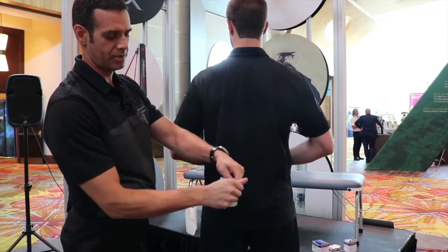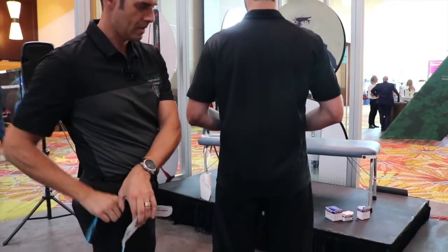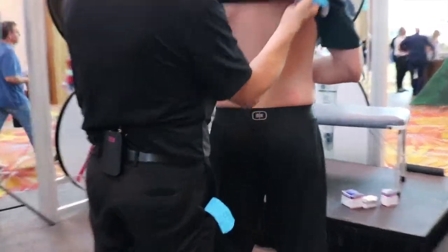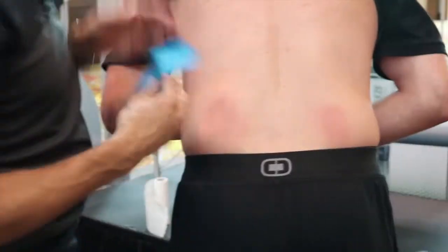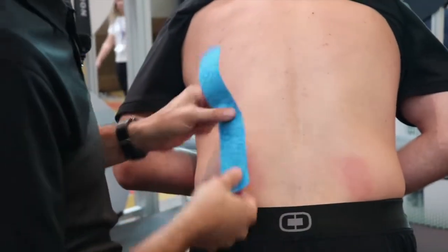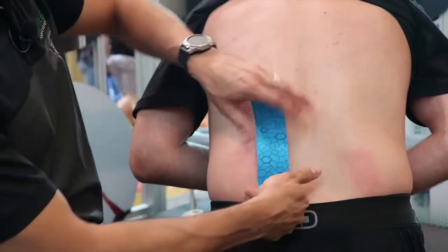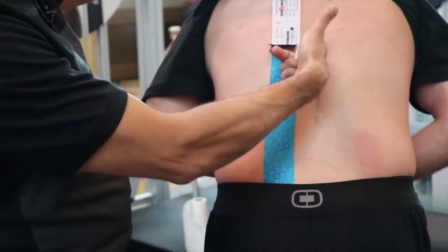So we're going to break a base where we're going to start by affixing the tape to his low back. So we'll lift up his shirt. And what I'm going to have him do is I just want him to put a little tension on the skin. So we're going to have him lean forward a little bit, try and round the back. And we'll start by putting some tape right at the base of the sacrum. And all we're doing is coming straight up.